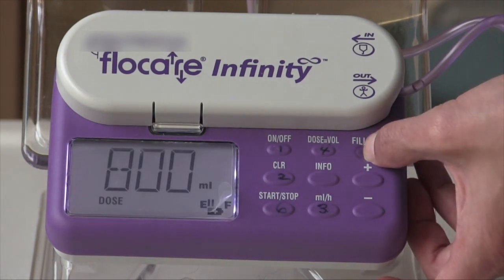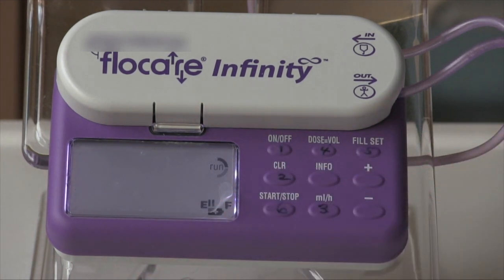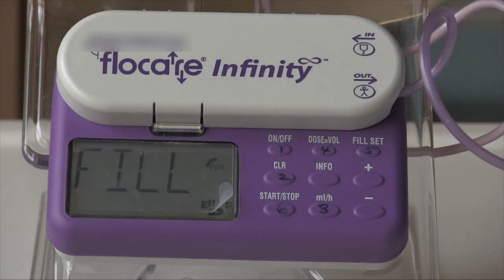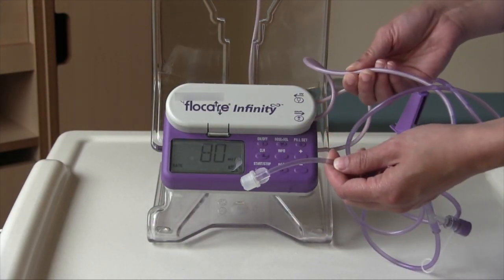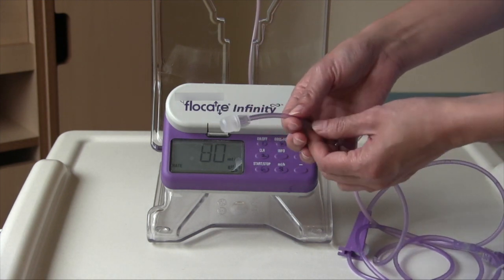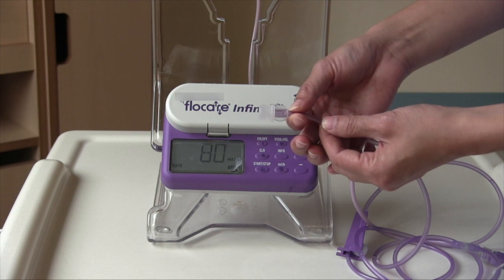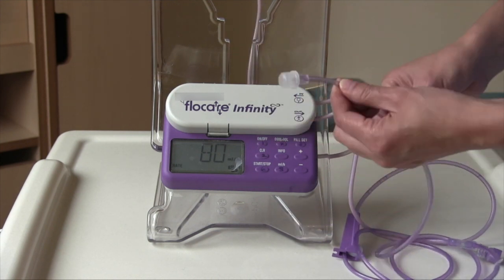So you'll push and hold for 2 seconds. You'll hear a beep and it will say fill set. So you'll notice now that the feed is being pushed through the tubing and there will be air that will be pushed out. During the fill set function, as your feed is filling the line, it will automatically come to about 1 to 2 centimeters before the end of the tube, which is okay. If you notice that the feed is going right up until the end and it's not stopped, you can press the fill set button again to stop the fill.